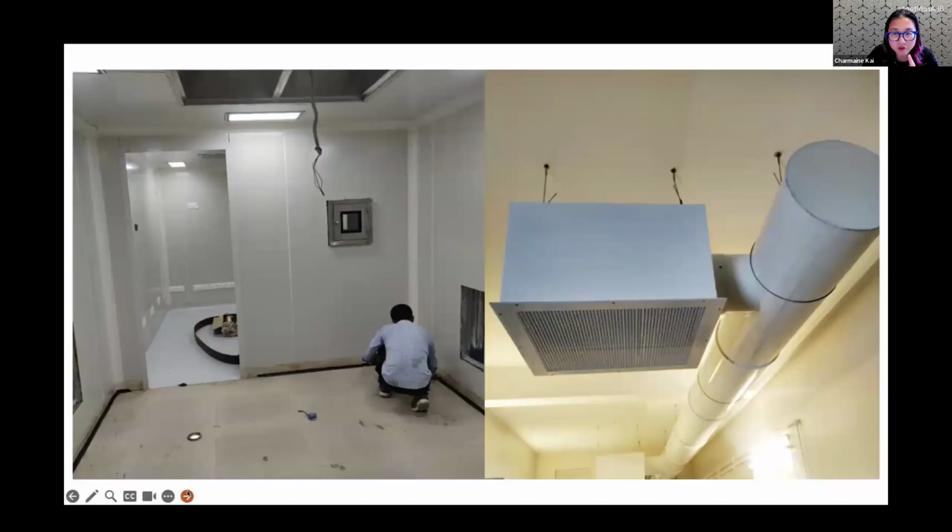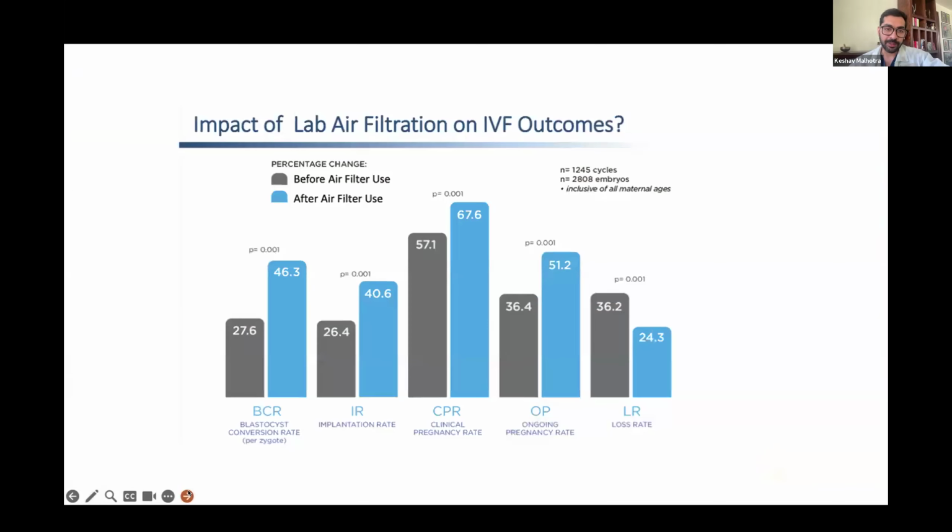The one on the right will have issues in terms of dust collection. In all labs, regardless if it's IVF or not, we try to minimize any areas where you can have dust collection. Even though we've got really good air going through, you will still get dust within an IVF lab. And above where the register is, no one's ever going to get up there to clean it. There'll just be dust all over, which can end up reducing your fertilization and blastulation rates, and also increasing contamination. It's a source of contamination which we need to avoid.